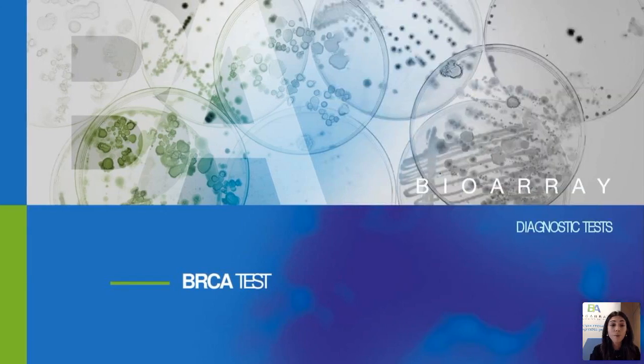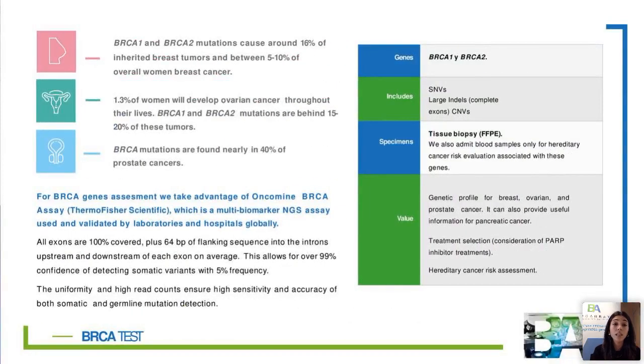Moving forward, now we change a little bit the type of cancers that we focus our tests on, and the first one is the BRCA test. This test is intended to check only the 2 genes of the homologous repair pathway, BRCA1 and BRCA2. These 2 genes, as probably all of you know, are well associated with different types of cancers, particularly breast cancer, ovarian cancer, and prostate cancer.